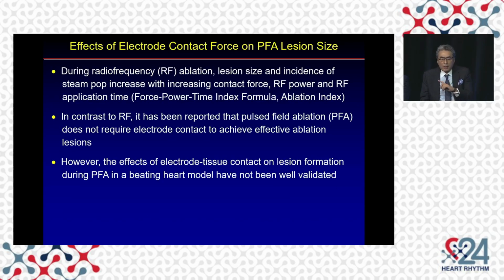So now I'm talking about the effect of contact force. Contact force is very important in RF, so therefore we developed the force-time index, the ablation index, to predict lesion size. Over the last 3-4 years, people have been saying contact is not important in PFA. I'm not sure. Actually, there's not much data. The effect of electrode-tissue contact on lesion formation in PFA, especially in a beating heart model, has not been well validated.